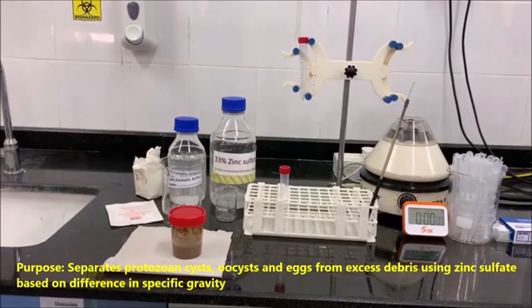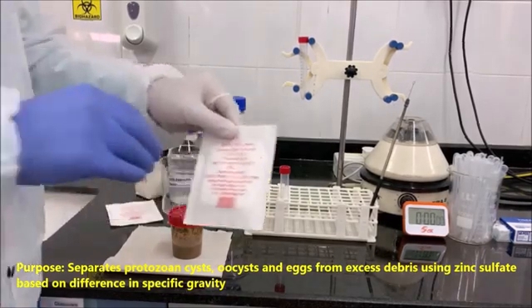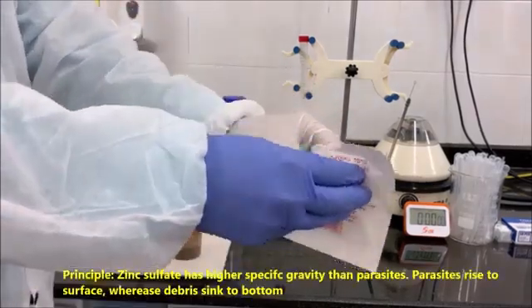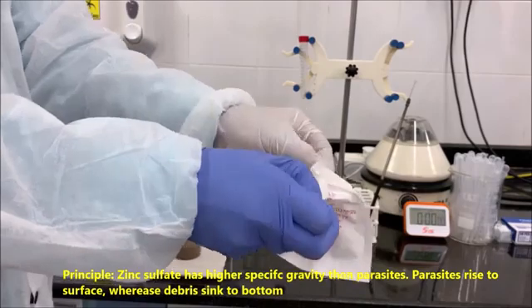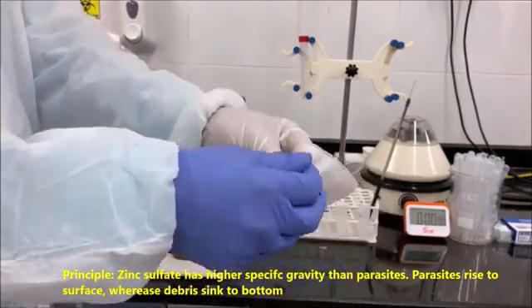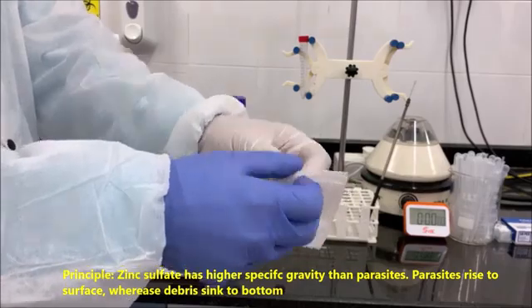Purpose: separates protozoan cysts, oocysts, and eggs from debris using zinc sulfate, based on difference in specific gravity. Principle: zinc sulfate has a higher specific gravity than the parasite. Parasites rise to the surface, whereas debris sinks to the bottom.